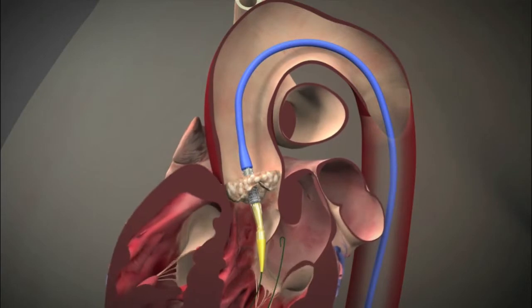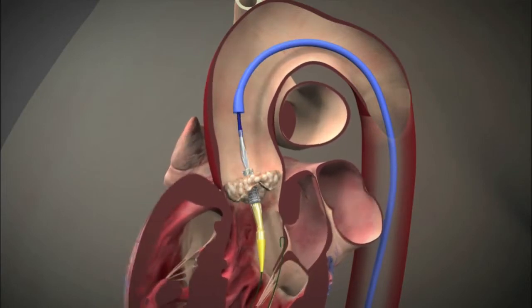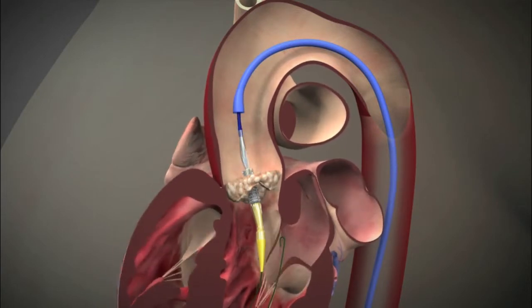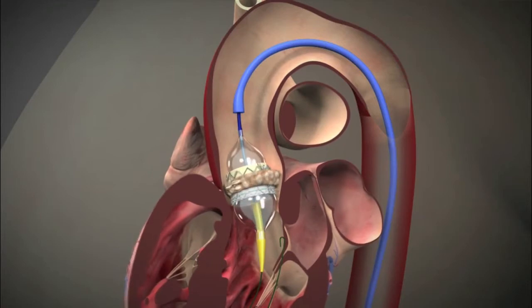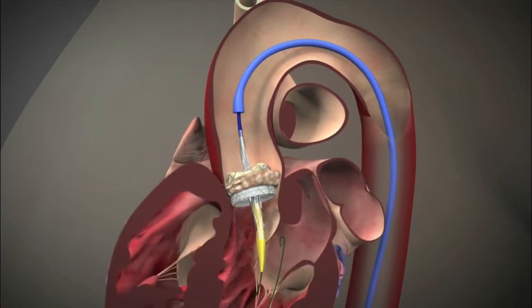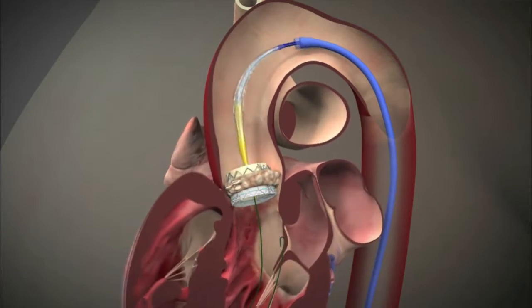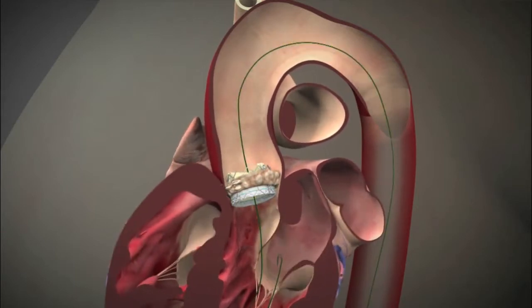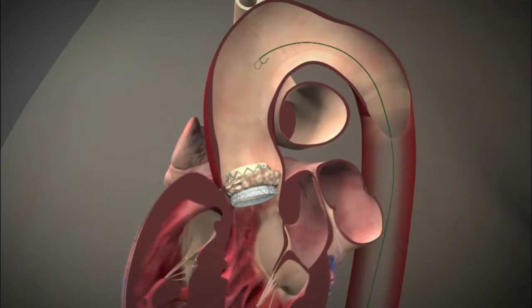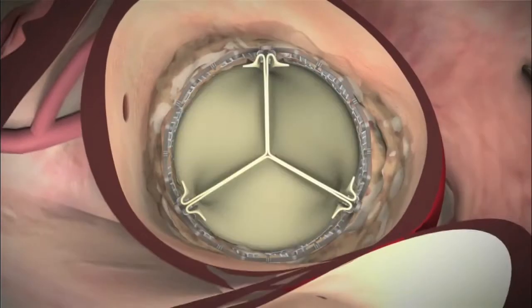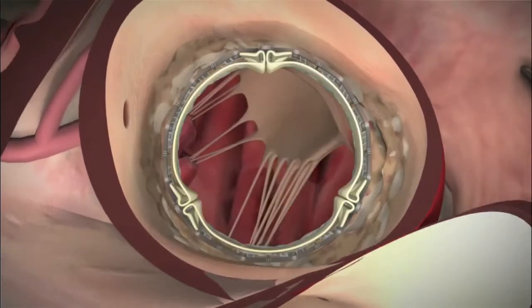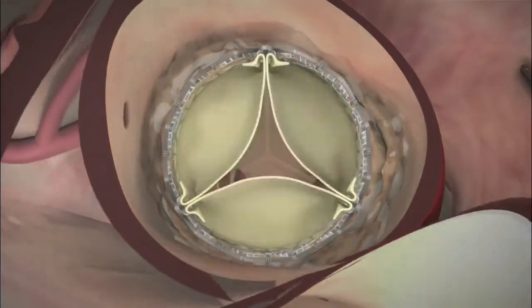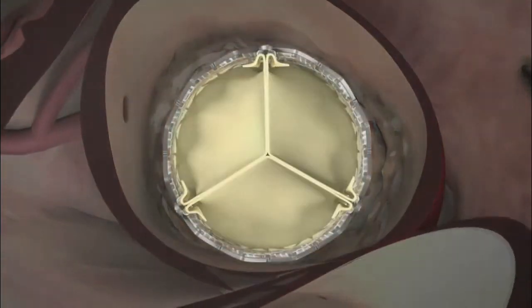The new valve, which has been tightly compressed up to this point, is ballooned open, pushing diseased leaflets out of the way and leaving a new, functioning aortic valve inside of the original valve. The wire is then removed. Here you can see the leaflets of the aortic valve opening and closing, restoring normal blood flow through the valve.